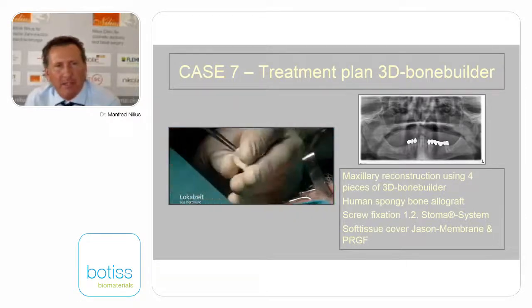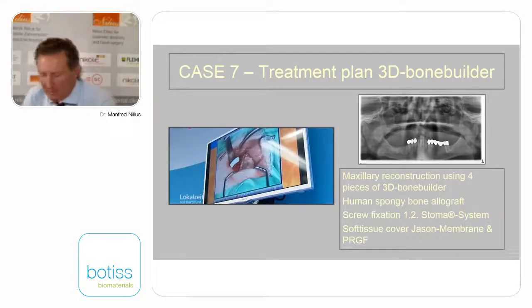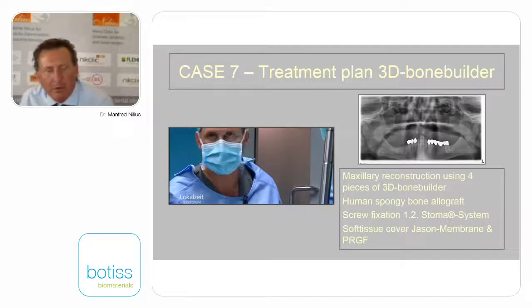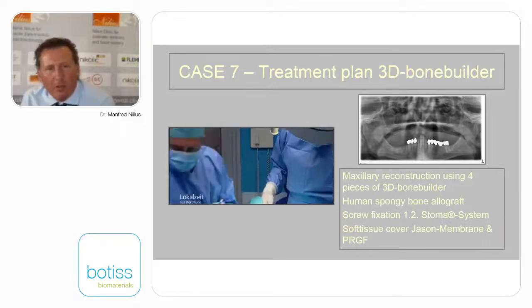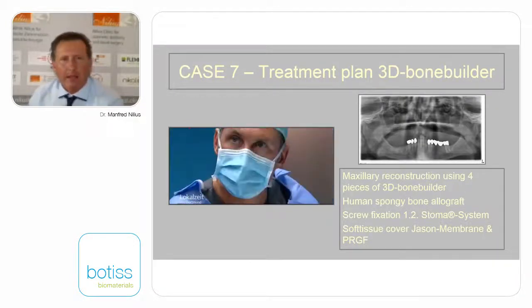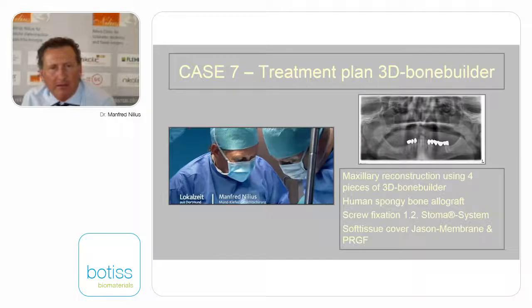I'll do some explanation, yes. Von einem Spender. Und der wird aufgebracht und bietet jetzt eine Leitstruktur. And I'm just explaining some morphological changes in rebuilding the bone, and just telling after 6 months there is almost native rebuilt bone. Das verlängert die OP-Zeit erheblich, denn der Knochen muss erst passend gemacht werden.